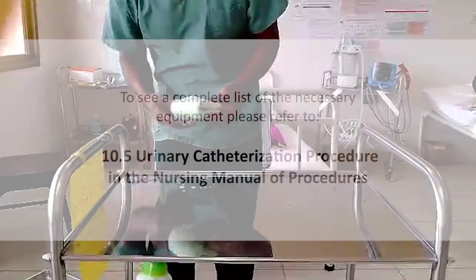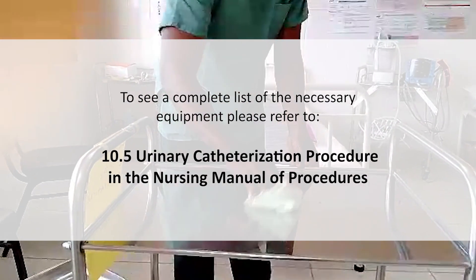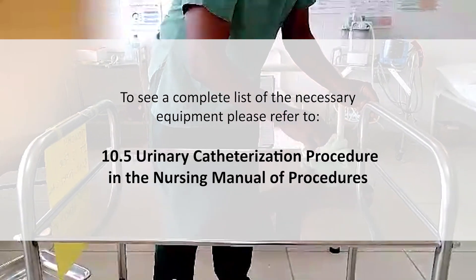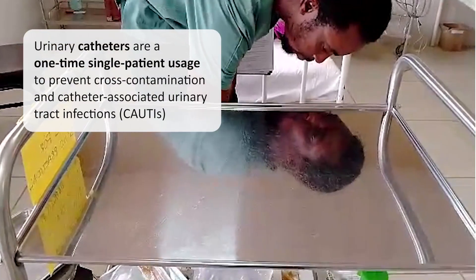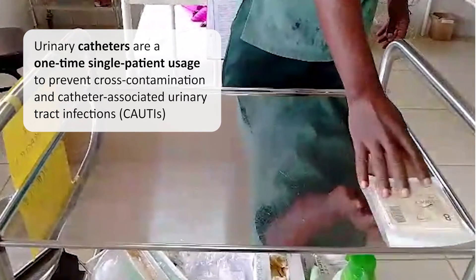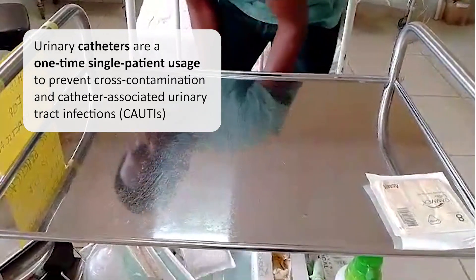As mentioned earlier, to see a complete list of necessary equipment, refer to 10.5 Urinary Catheterization in the Nursing Manual of Procedures. But here are a few key items to remember. First, urinary catheters are a one-time, single-patient use to prevent cross-contamination and catheter-associated urinary tract infections.